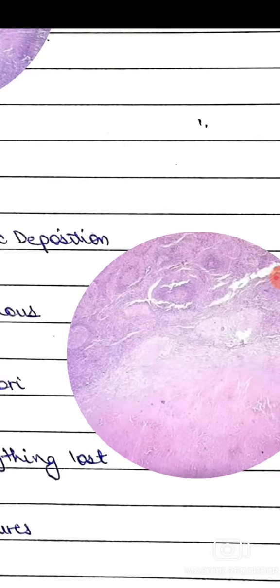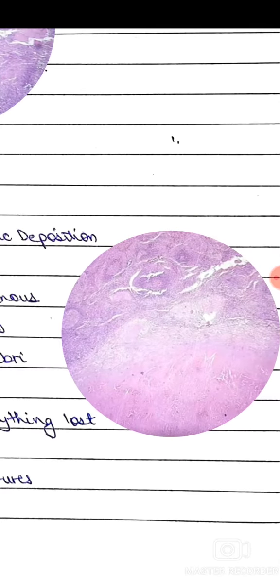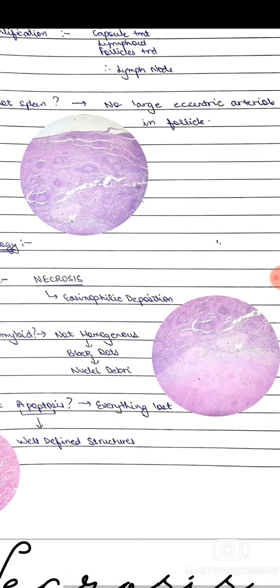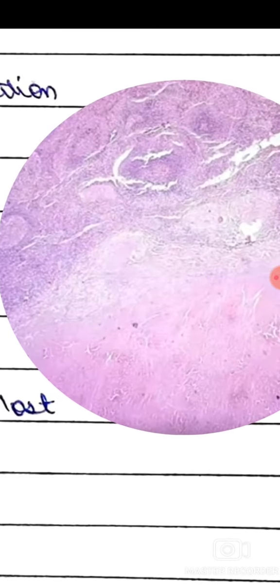We see a pinkish colored area where we can see eosinophilic deposition. This is an area of necrosis.